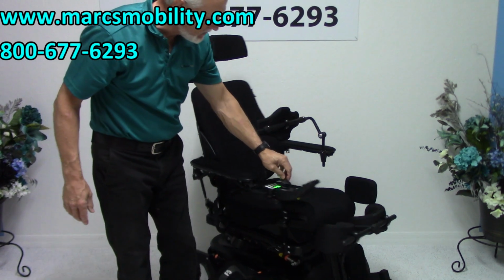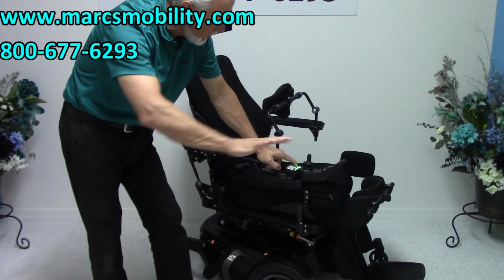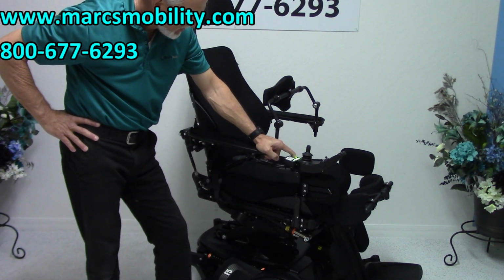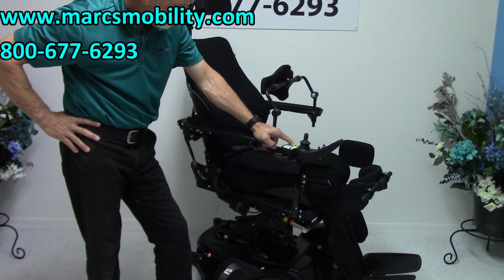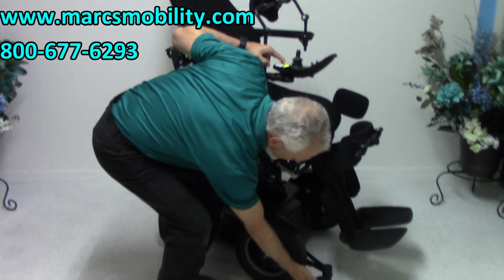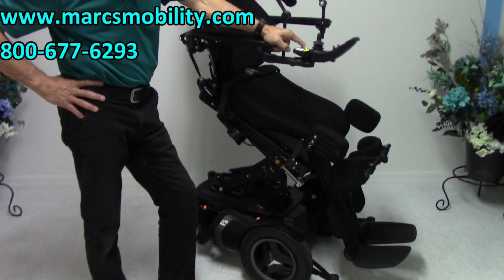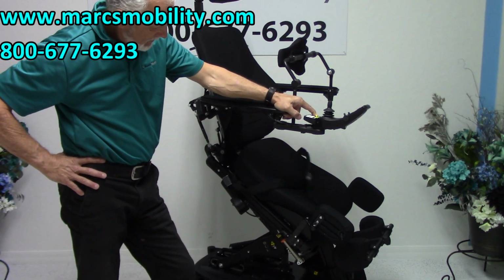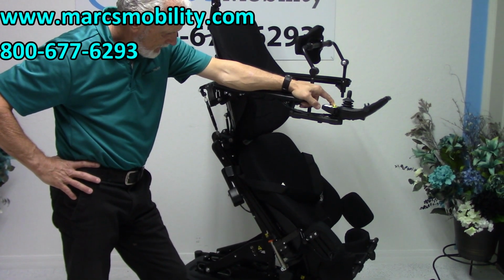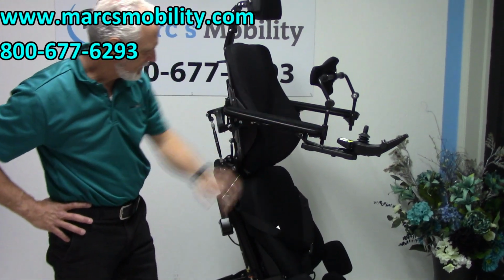So when you're going to do the standing position, you want those two things set up. And then you'll hit the first button, and then you'll let the chair do what it has to do. It'll do all kinds of little functions here, but it'll work its way up to standing. And this is called the standing position, which is what this chair is famous for. You see the wheels are coming down? The nice thing about this chair, when you're standing, you can still drive this chair standing. So we're almost there. So this is called the standing position, okay?